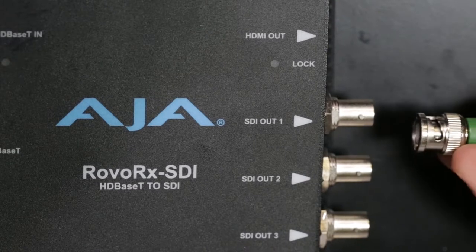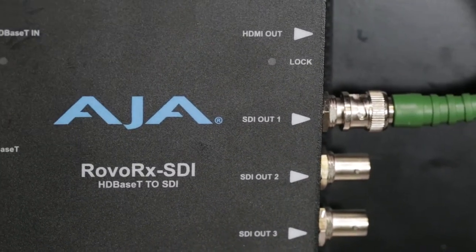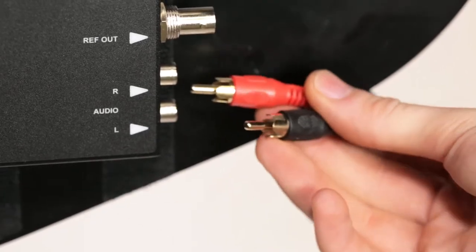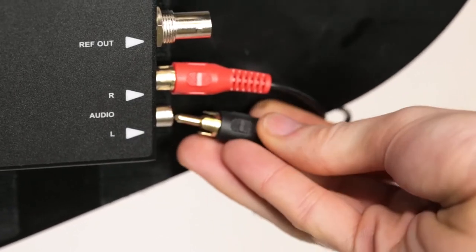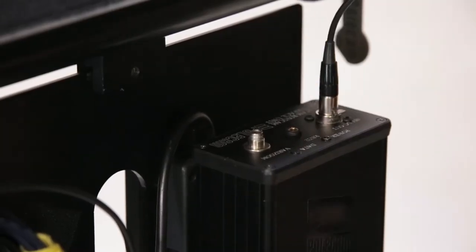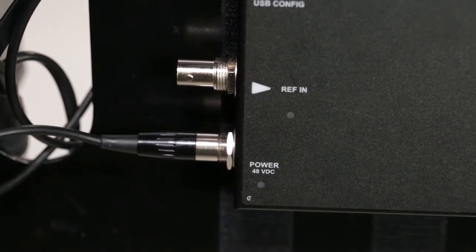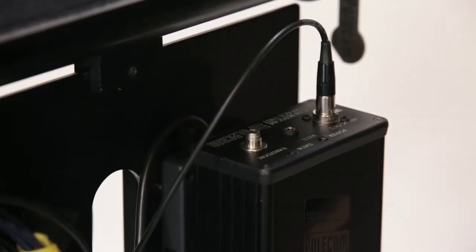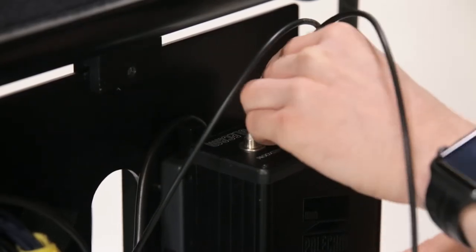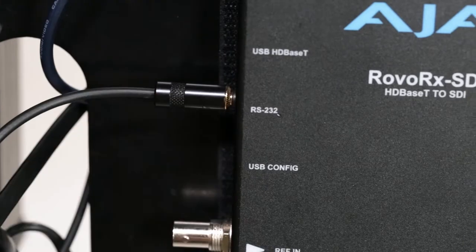At the base end of the pole cam, connect the monitor cable to output one on the RovoCam RX unit. Connect the two audio-phono leads by passing them round the front of the paddle and connecting as shown. Connect power to the RovoCam RX unit from the RovoCam interface unit, and connect the RS-232 cable between the output of the RovoCam interface box and the input of the RovoCam RX unit.